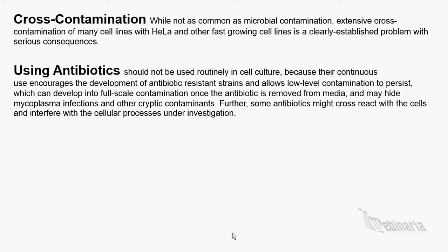Antibiotics should not be used routinely in cell culture because their continuous use encourages the development of antibiotic resistant strains. Okay, so this is the basic problem that we are facing nowadays, like tuberculosis. There is MDR, multiple drug resistant tuberculosis bacteria, and in many cases people are infected by antibiotic resistant bacteria, so it's very difficult to treat them. So to avoid this, routine use of antibiotics is not recommended.